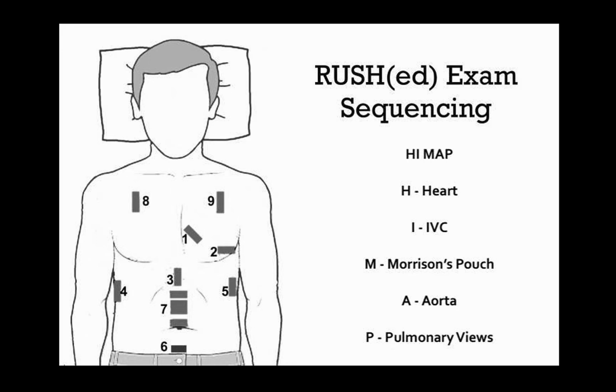The aorta is then scanned to look for evidence of a possibly contributing AAA, and then bilateral thoraces are scanned to look for pneumothorax. The phased array probe can be used universally, but if time allows, you may decide to use the high-frequency linear or curvilinear probe for thoracic views and the curvilinear probe for abdominal aortic scans.